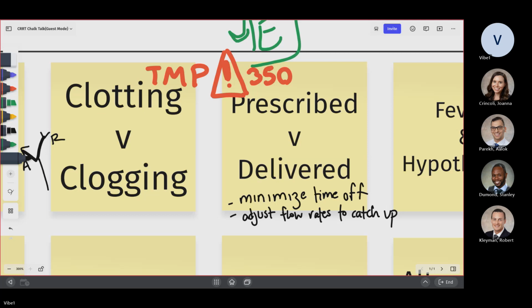Earlier we used to say, oh, I just want 25 cc's. So every time there is any change... the thing here is you guys are more in the ICU compared to me. I'm not there 24 hours, so you guys keep on seeing the patient hour to hour, so you can always play around. That's why we give a broad range, like say, okay, 25 to 75 cc's an hour, and you guys can always titrate and play around with it.